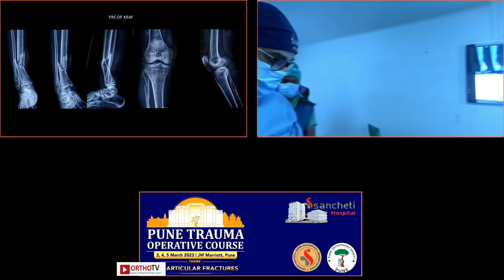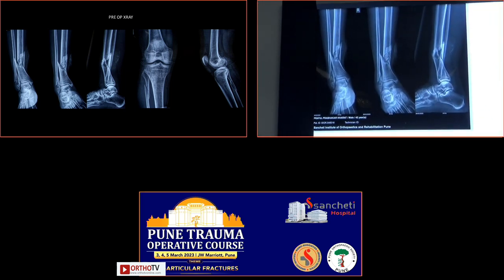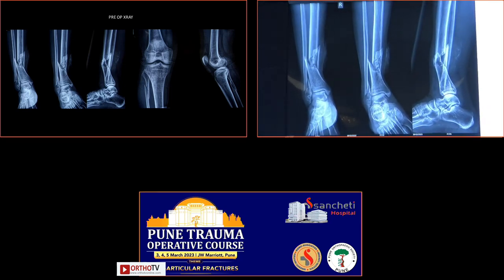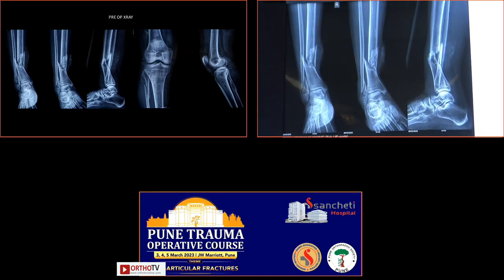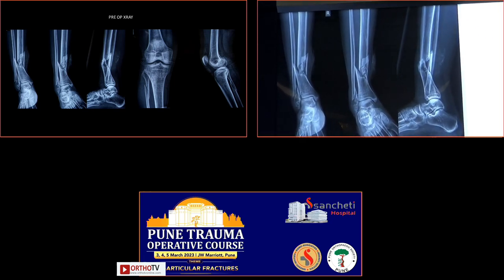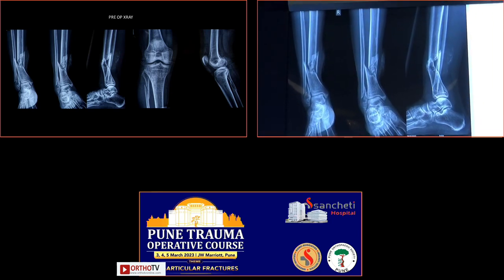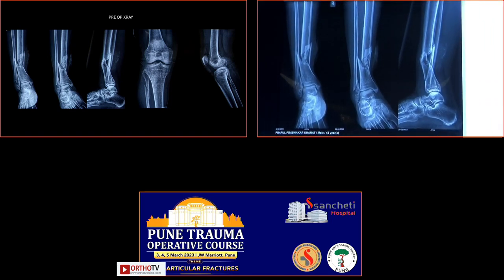You have already seen the x-rays, but if you see this, it's a lower third tibial fracture. There is a fracture line going down towards the ankle. And we believe that there is enough working length for a nail. So, this is a kind of an extended indication for distal tibial fracture for nailing.